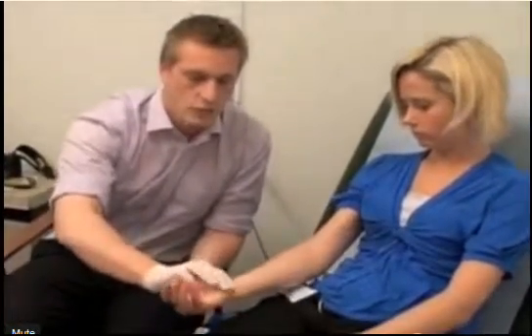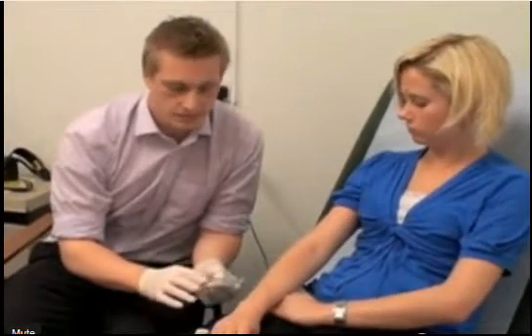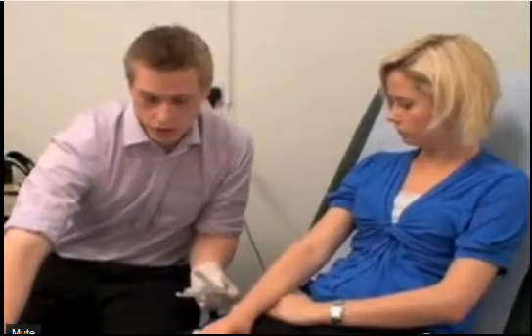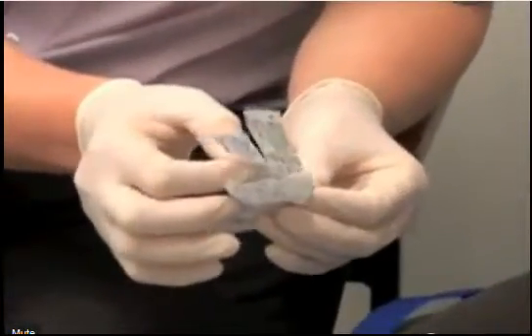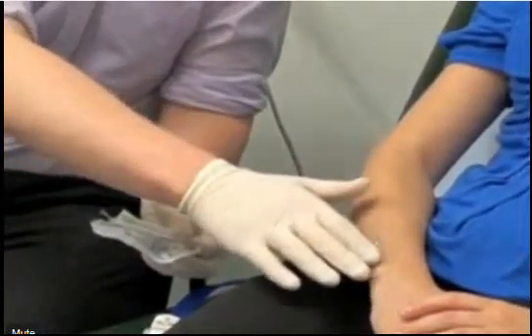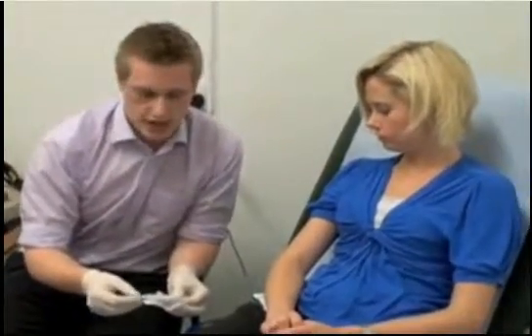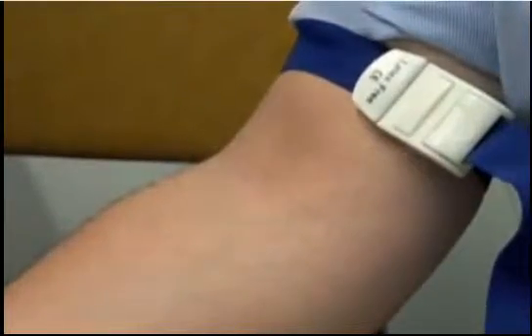The needle and syringe allows access to smaller veins, such as the cephalic vein or the small veins on the back of the hand, which are much easier to reach with a smaller needle. When setting up, you can choose needle size — with the vacutainer you only have one choice, but with a syringe you can select any compatible needle. Generally a green (large gauge) needle is used in the antecubital fossa, but for the hand use a blue or even gold needle. Always check the color coding on the packaging as it may differ between hospitals.